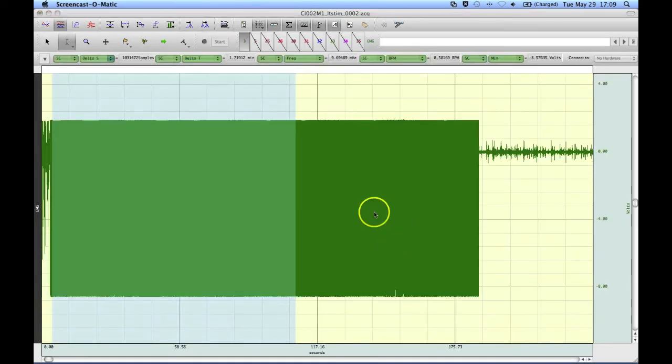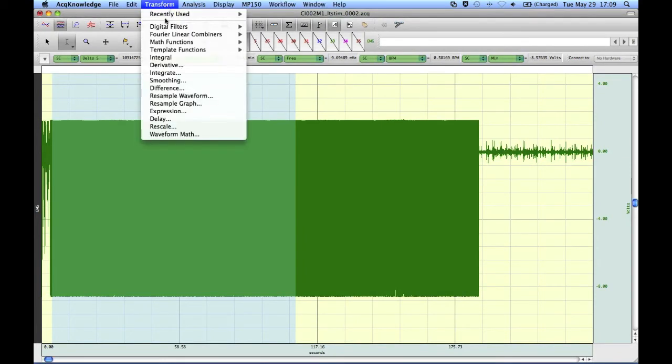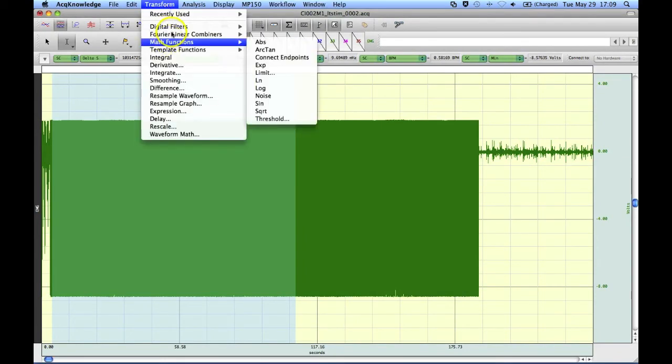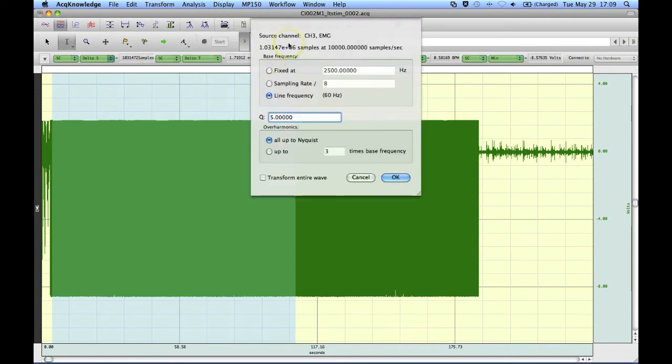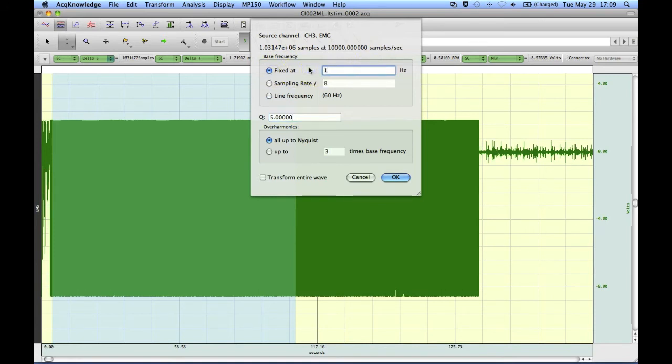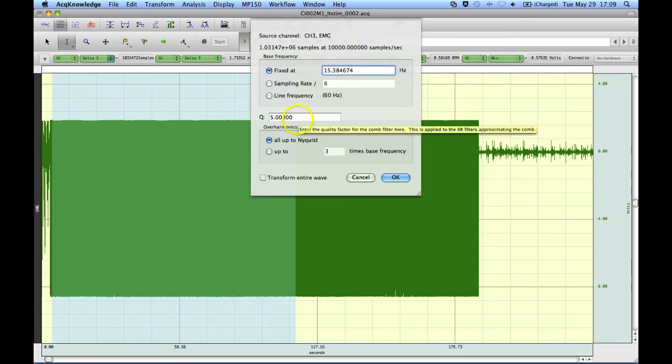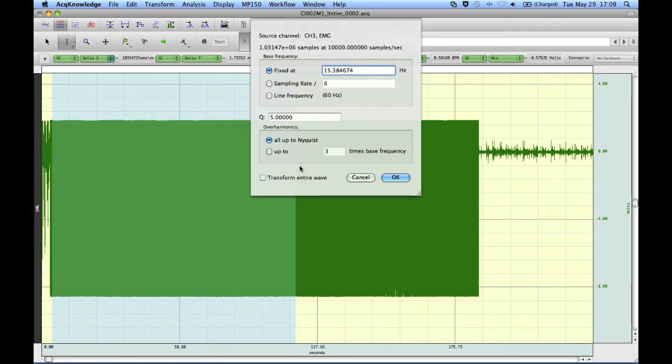I'm going to use that number to enter into the comb band stop filter. So if we come in here, I'm going to use my value of 15.384674. I'll leave the Q the same. I'll go all the way up through the band. And I'm going to transform the entire waveform. Hit OK.